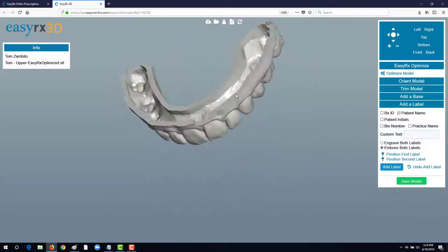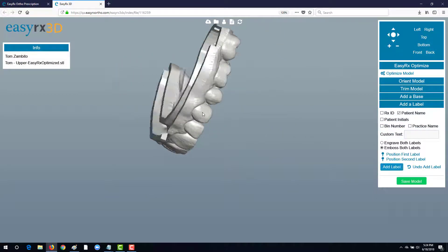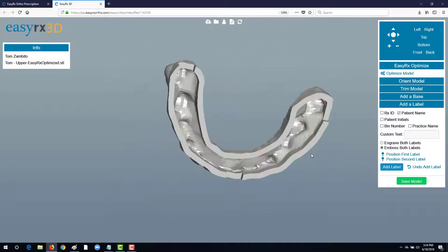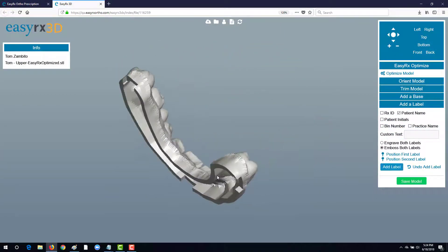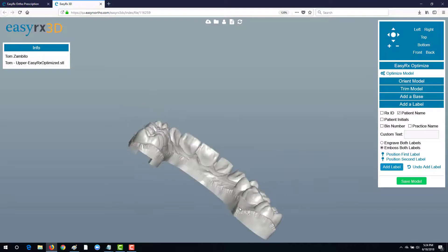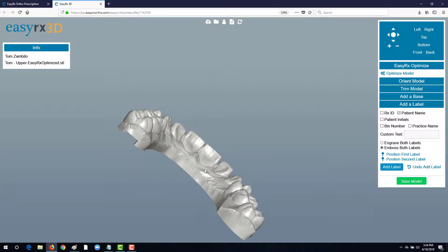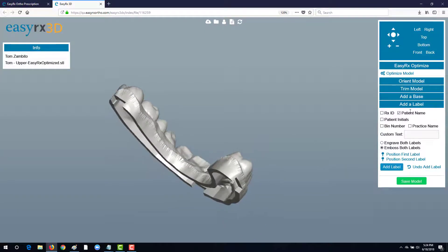You'll see the base has now been placed along with our hollow walls and we're going to now put on a label to identify it.